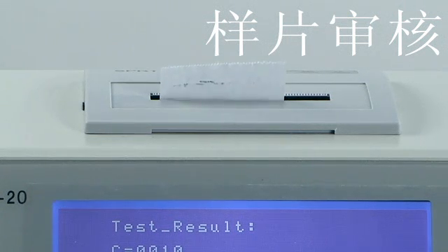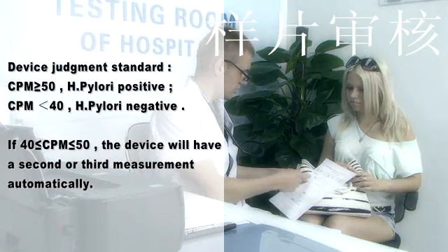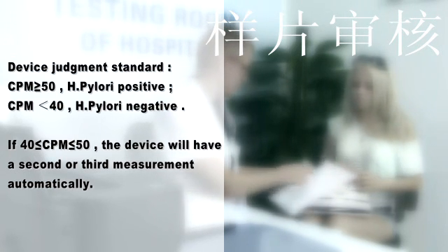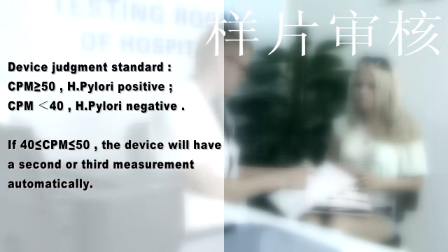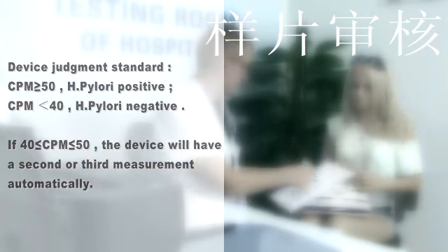Report printing: the device displays and prints the result automatically upon completion of measurement. Device judgment standard: CPM greater than or equal to 50 means H. pylori positive; CPM less than 40 means H. pylori negative. If CPM is between 40 and 50, the device will automatically perform a second or third measurement.